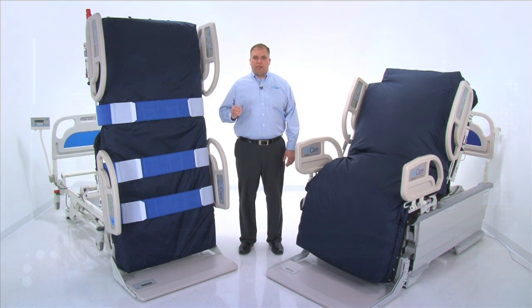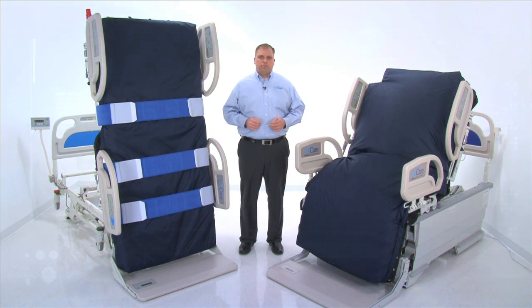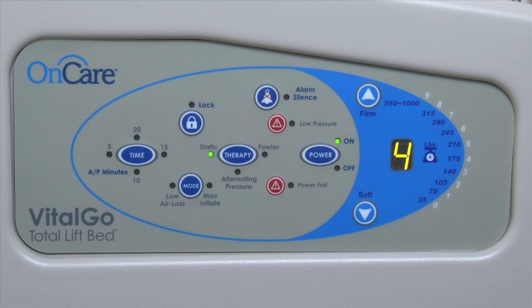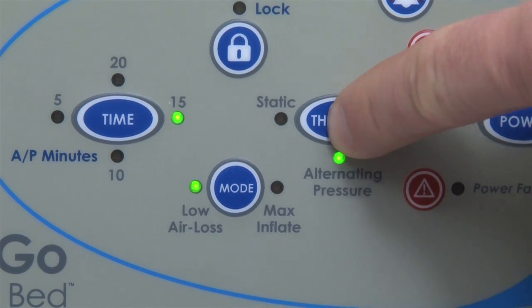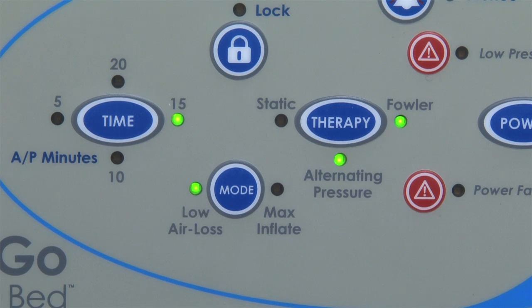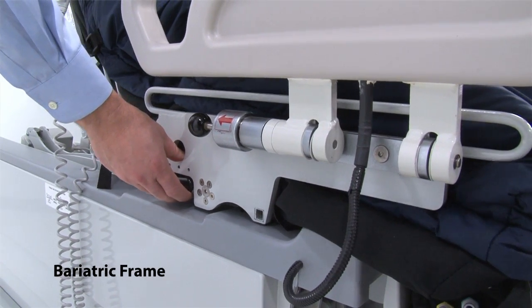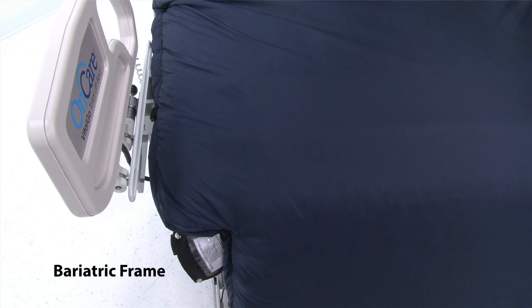Designed to support your facility's wound prevention and treatment efforts, the Total Lift Bed features an integrated therapy surface designed for treatment of wounds up to stage four. Integrating the air mattress into the frame helps reduce noise and eliminates the hassle associated with accessory pumps. The air mattress controls are conveniently located on the foot-end side rail and include low air loss therapy, alternating pressure, and customized pressure settings based on patient weight. When needed, a Fowler support feature will engage automatically to prevent the patient from bottoming out. A CPR release is included in case of an emergency.